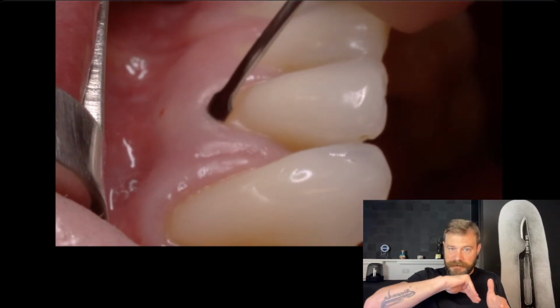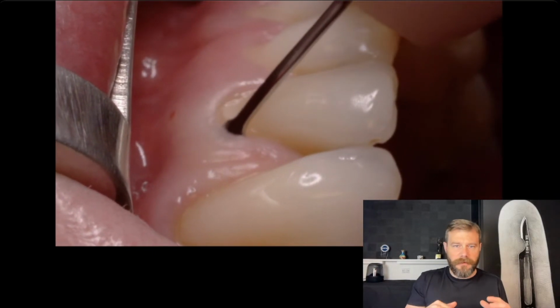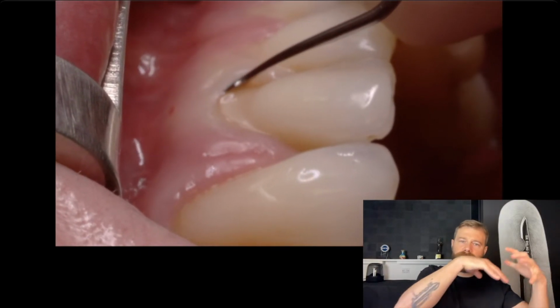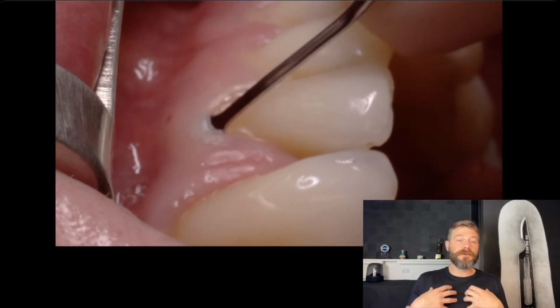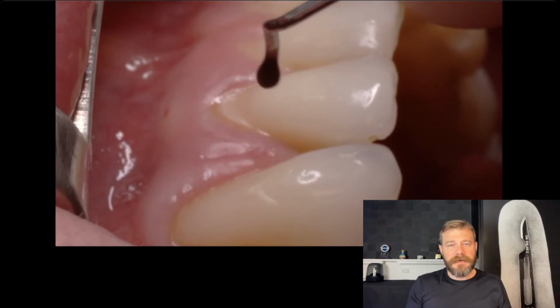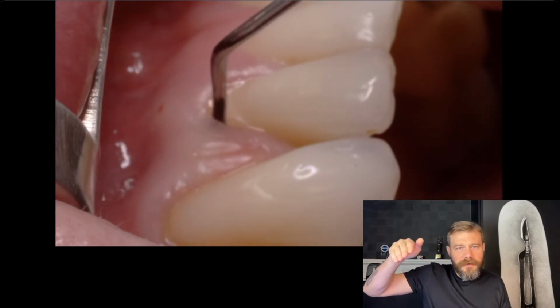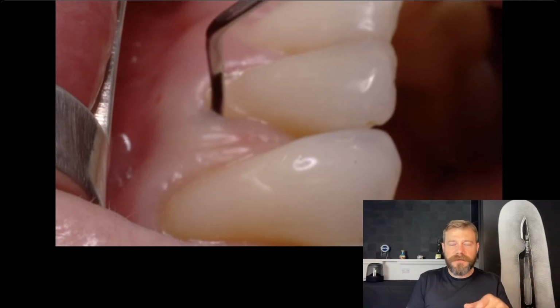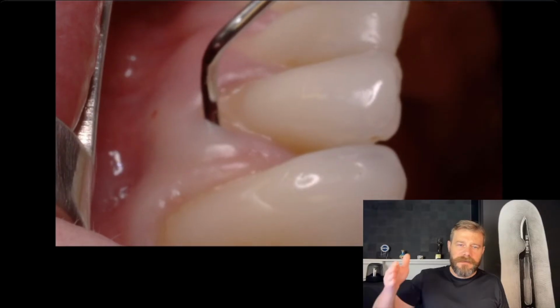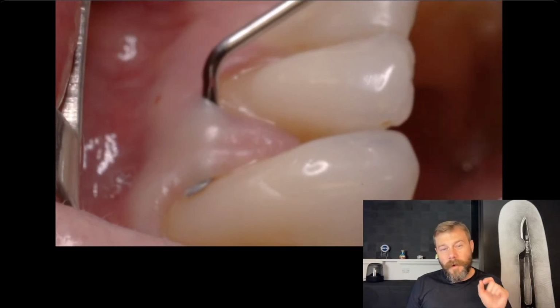So that was the first tip. Go inside the sulcus, breaking the attachment of the sulcular area, the long junctional epithelium and the connective tissue attachment. I'm going to bring all the tissue together on the flap. That is going to give me a stronger flap during the healing stage. After that, I can bring in the papilla elevator. You see it go inside the sulcus. You see the sulcus not being stretched, completely in its position, and slowly detaching the base of the papilla. Okay, wonderful. Why is that?